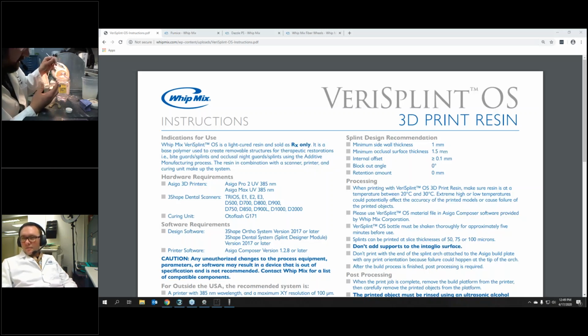We had another comment and question come in. I thought after printing, then some grinding and polishing, the job is ready. In this webinar, there will be another round of curing, then polishing. Don't we have a system yet that prints a job and goes directly to the patient's mouth? I think there might be a little confusion on this subject.